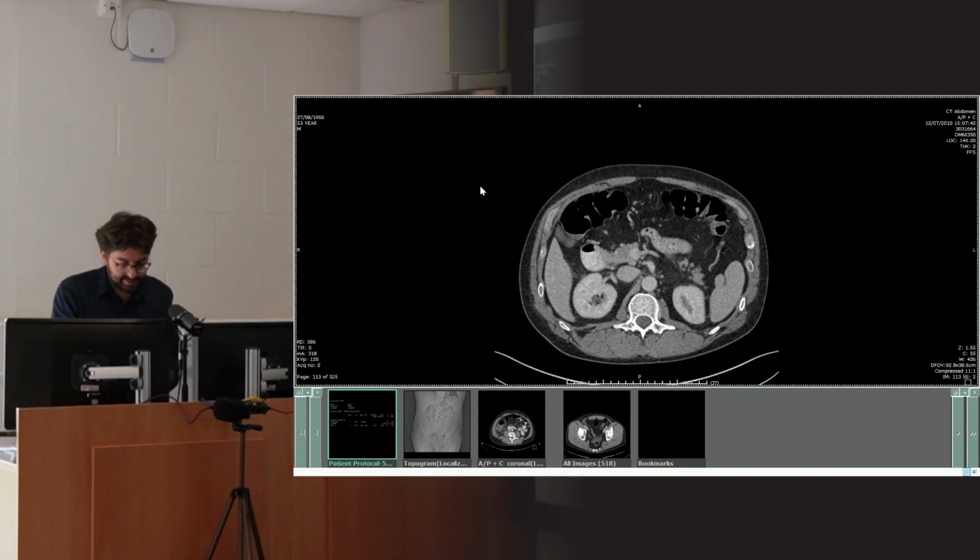Inflammation makes vessels leaky. Leaky vessels leak fluid. And so if an organ is inflamed, you get fluid leaking into the fat around the organ. And that leads to something called fat stranding. You may have, again, seen that term in radiology reports and wondered what it means. That's basically what it is. It's edema or fluid, strands of fluid usually, in between lobules of fat. And basically, the organ that's surrounded by the fat stranding is the organ that's inflamed. It's basically as simple as that. CT is actually, I think, the easiest modality to understand in radiology.